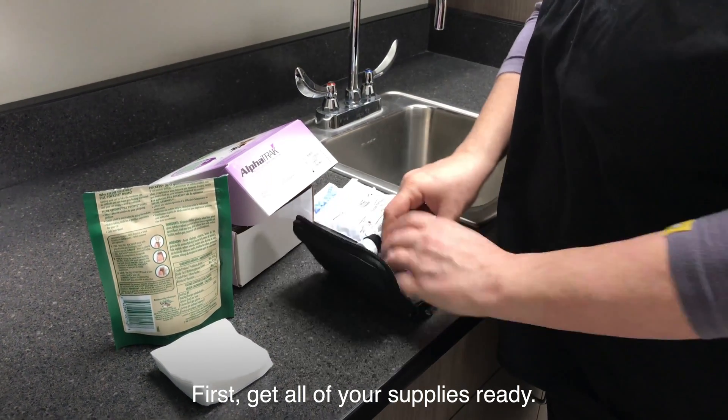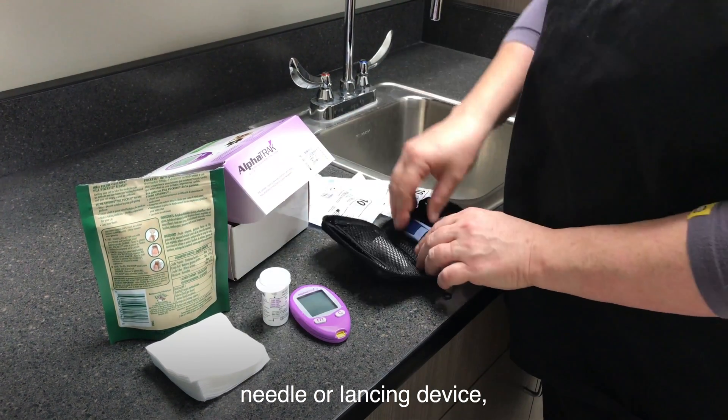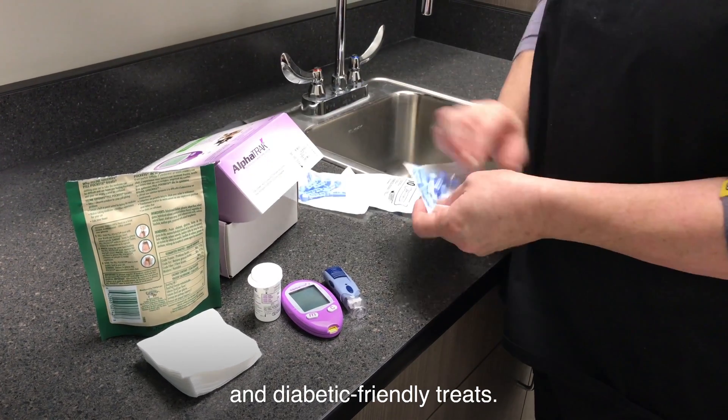First, get all of your supplies ready. This includes a glucometer and test strips, needle or lancing device, cotton ball or gauze, and diabetic-friendly treats.